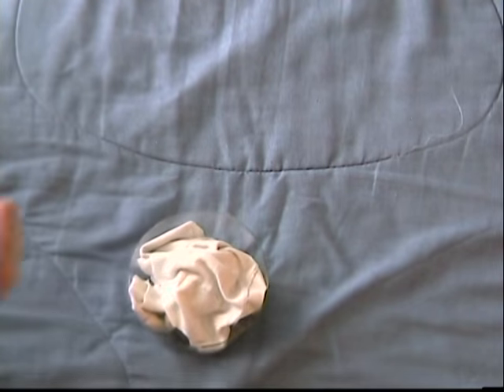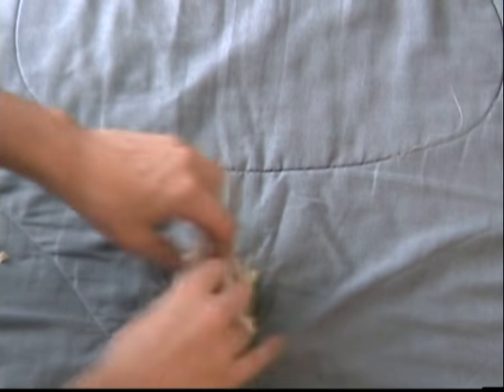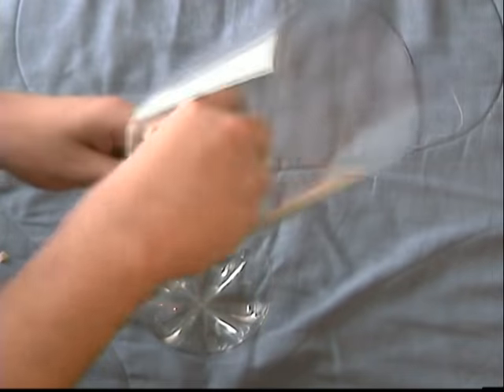Now soak the sterile rag in vinegar and place it at the bottom base of the mask. When done, it should look something like this.